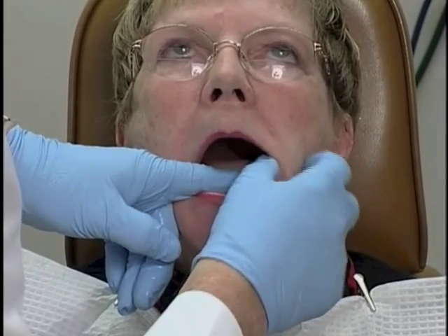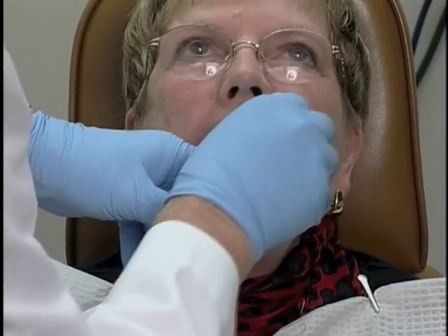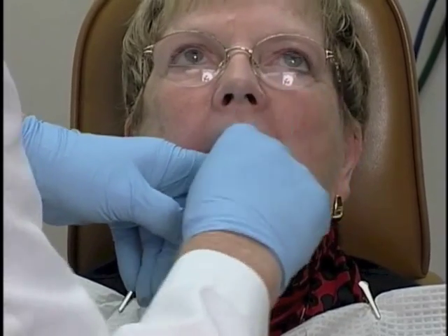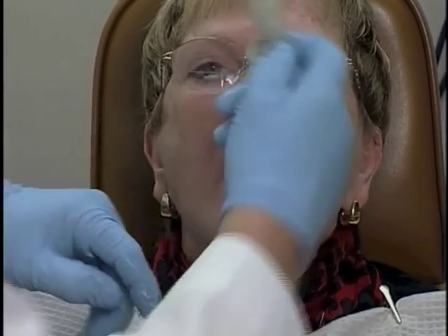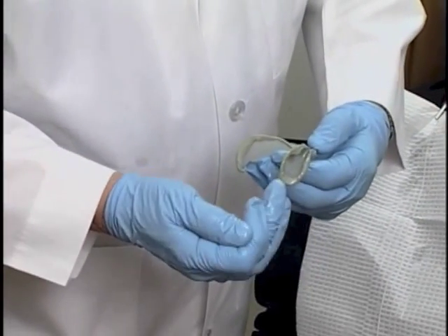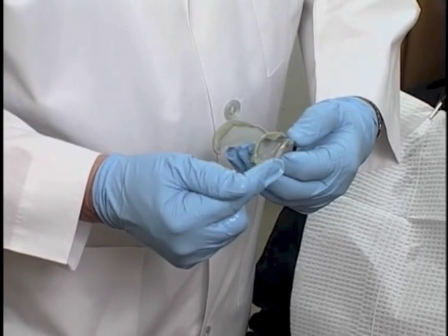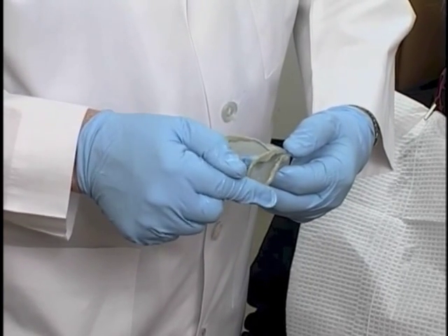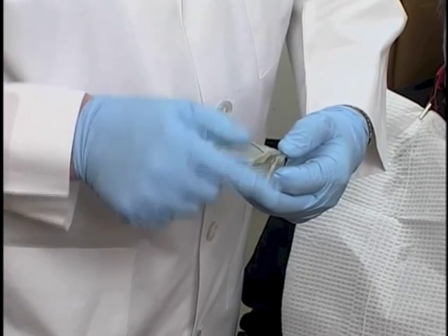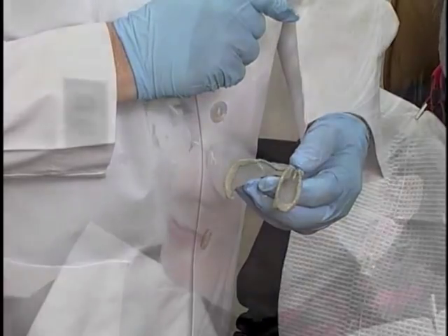And this time we grasp the cheek with the thumb and forefinger and pull it up, backwards, and forwards. And here we have a very nice border molding of the distal of the retromolar pad, the masseter muscle region, and the facial region from the retromolar pad up through about the buccal frenum area.